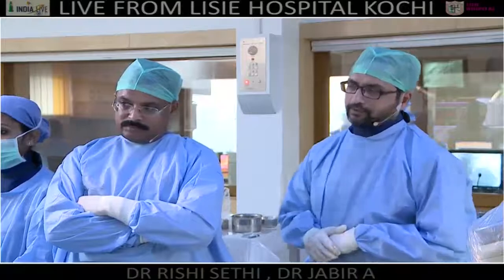Let me provoke you, how many of you would go ahead and do an imaging of this OM? If I'm in doubt, I will definitely go and take it. If I am supposed to do this angioplasty, my important vessel is the OM. I will be stenting from circumflex to OM. Right. I will make a bifurcation. That's exactly right. That should be done.